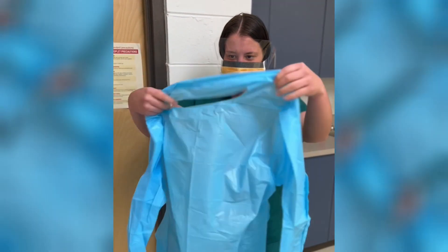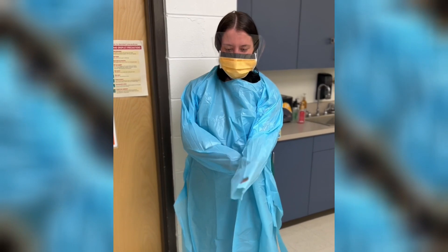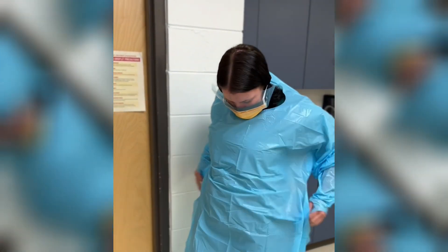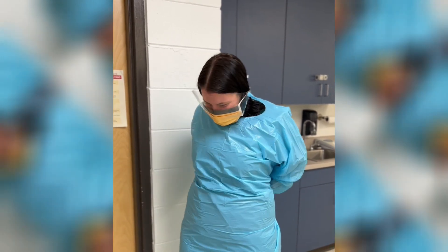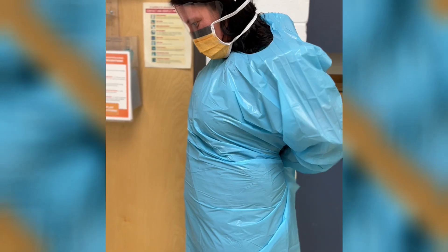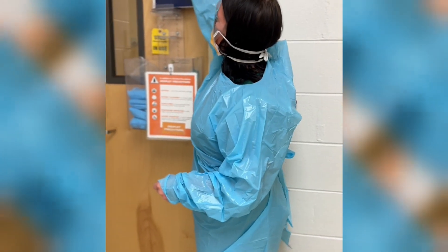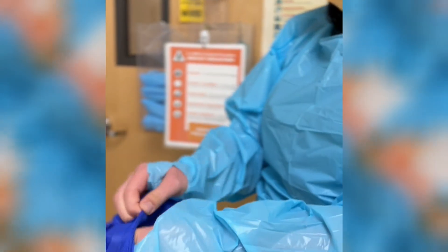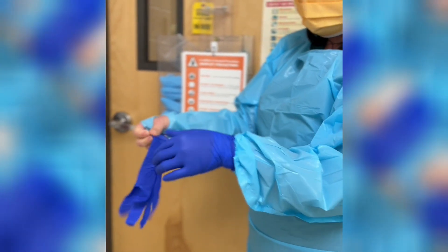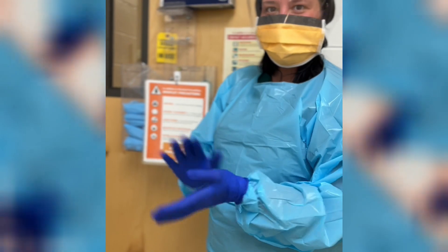There's a little hole on the top of the gown — you're just going to put it over your head, then put your arms through the sleeves. There are thumb holes, so you're just going to put your thumbs in there. Then you've got to tie your gown around your waist. Once your gown is tied, you're going to put your gloves on — you want to put your gloves over top of your gown. Then you can go into your room.